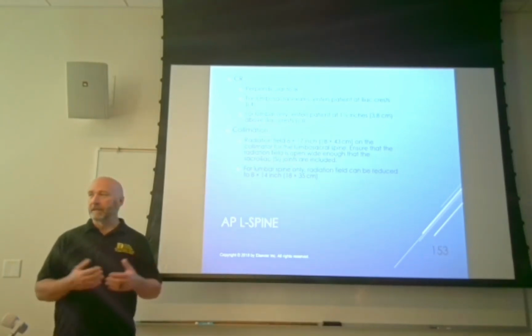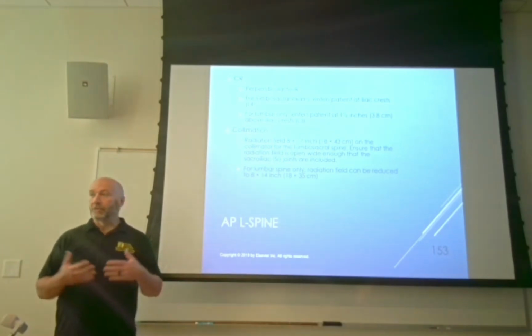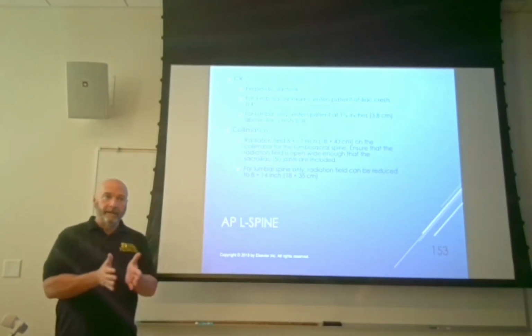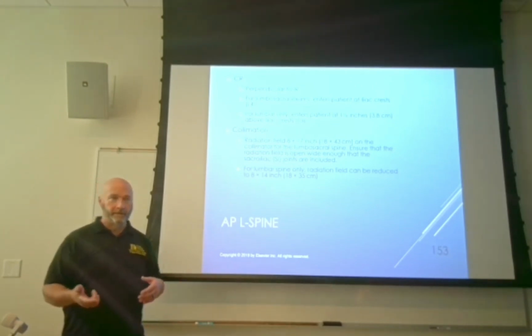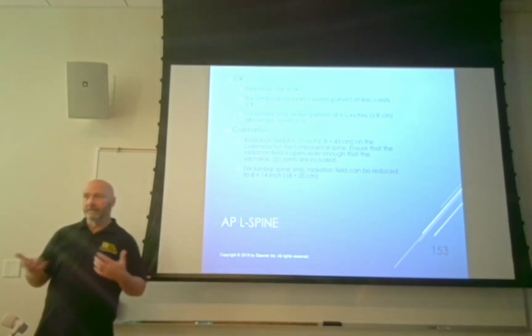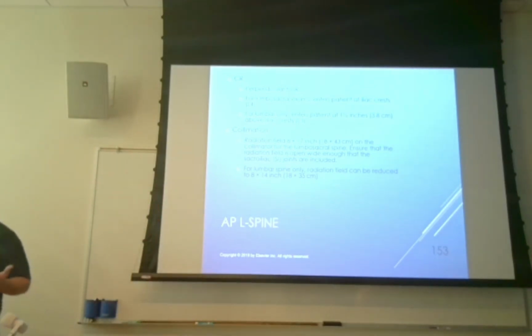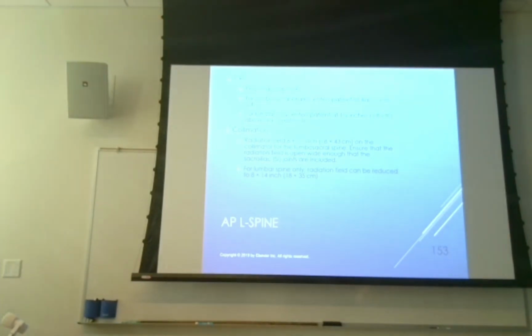It's hard to identify exactly what's going on with the patient. So some of your doctors are going to want, instead of a collimated AP, they're going to want you to shoot a KUB for the AP of the L-spine. Okay, so know your doctors, know your protocols, and regardless of what we say up here, this is for testing, but in clinicals, do what the doctor wants.